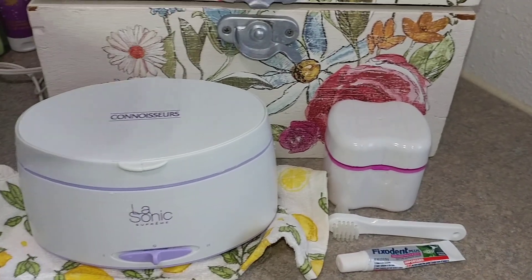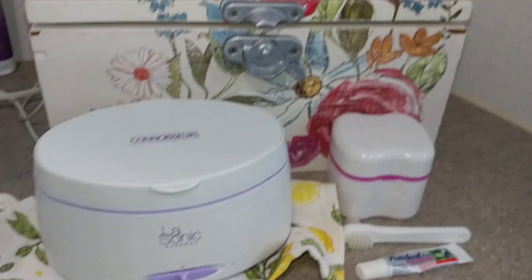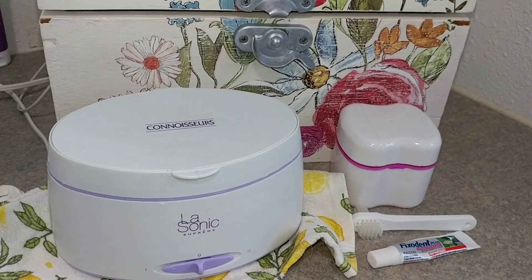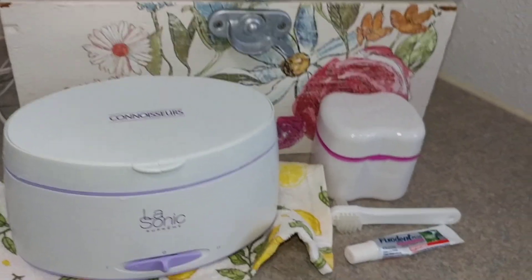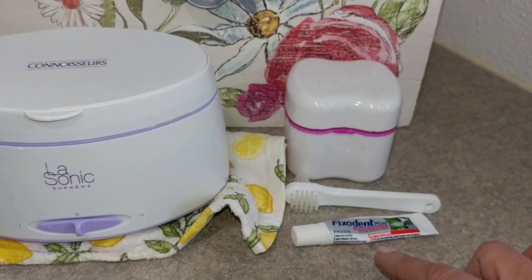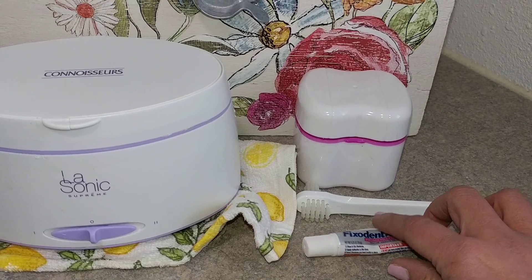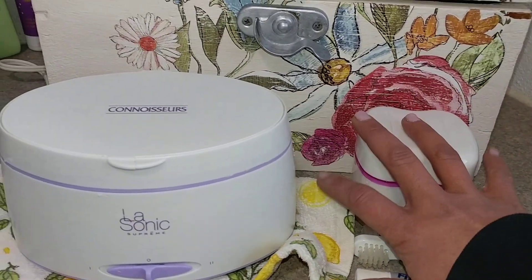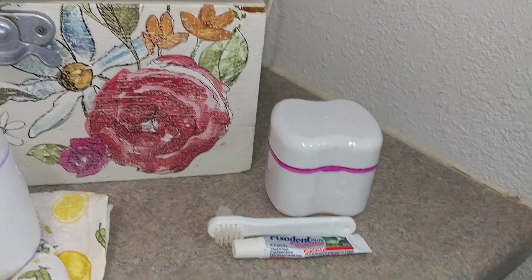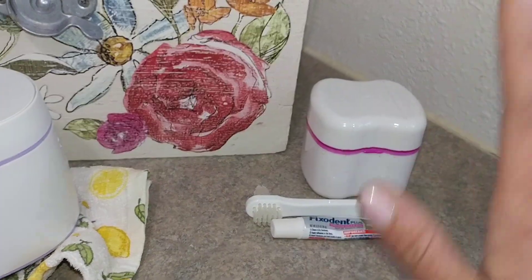Hi guys, it's April again. I am just stopping in to talk to you guys about some questions about things you should have on hand when you receive your dentures. I will go ahead and show you that this denture bath, this brush, and this tiny tube of adhesive is what I left my dentist's office with — no cleaner, nothing. This is what the dentist gave me and that's fine.